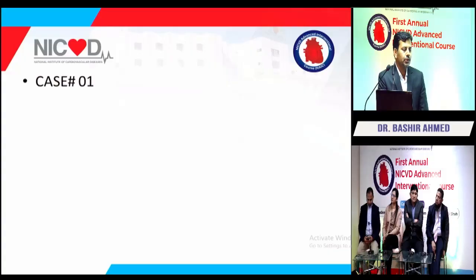After discussion regarding this, I'm moving to a case. It's an important case. Giving you the background of this case, this patient was an 80-year-old male, probably a retired judge, and he had anterior wall MI and presented for primary PCI. Ballooning was done, but stenting was not done, and the patient was discharged from the hospital and came again after 2 weeks with typical chest pain. So the plan was to proceed, recath, and further elective plan was done.